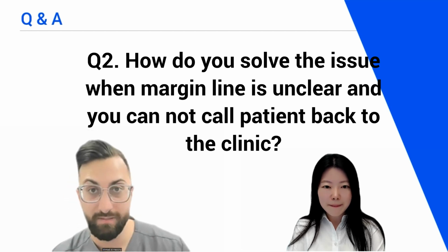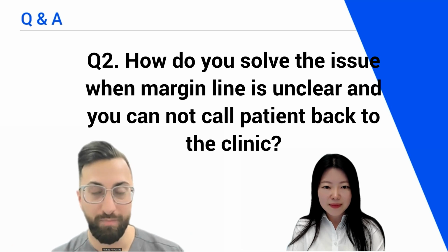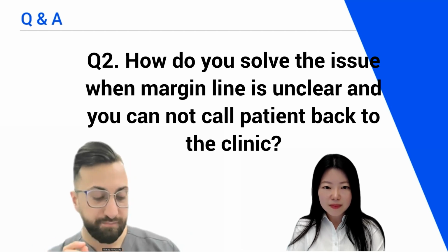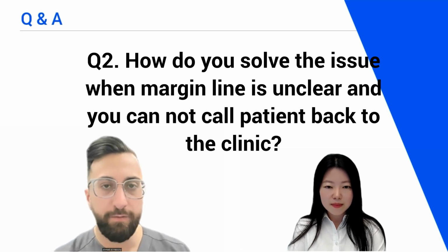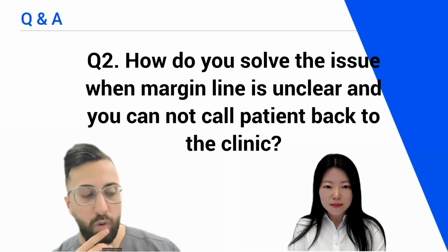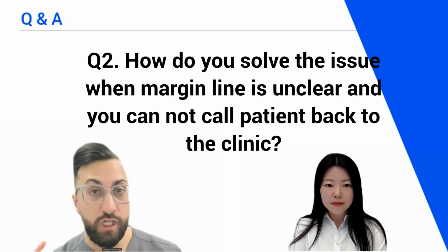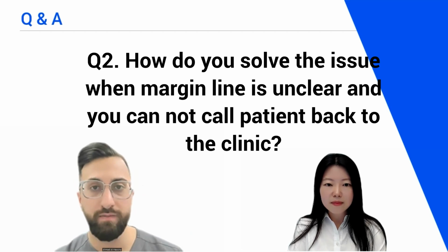I would suggest, like in our job, prevention is better than cure. Before you let the patient leave, you should always check your scans. Always. And you don't have to meticulously check everything. If it's a crown prep, just check your crown prep and the contact areas. So my best advice will be to make sure you control bleeding, retract properly, scan properly before the patient leaves, so you don't have the stress.